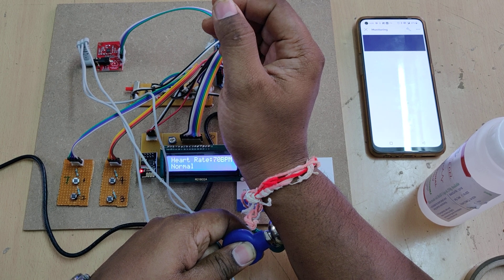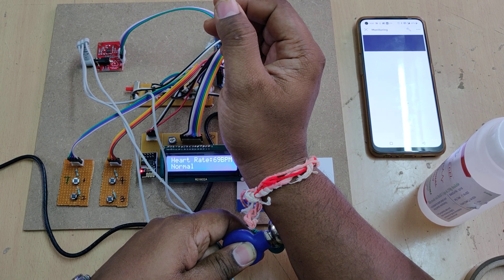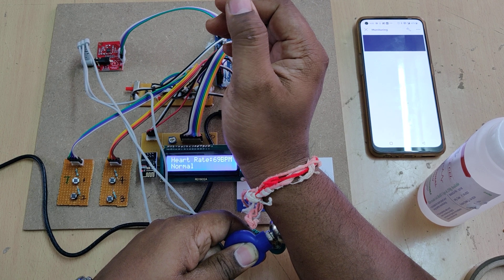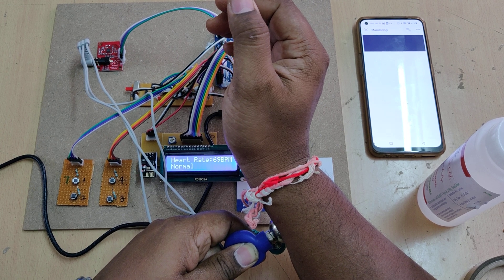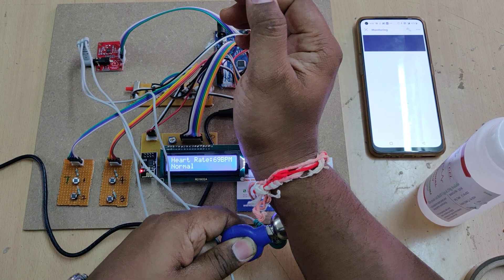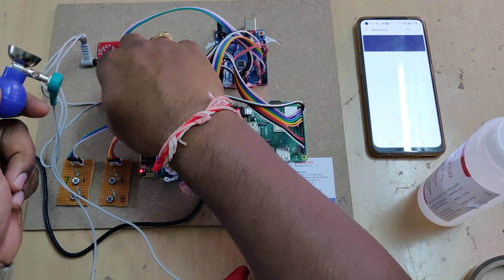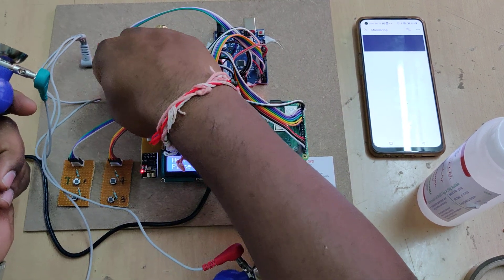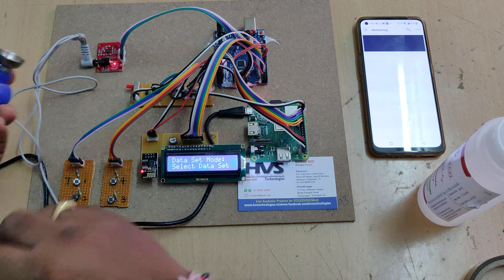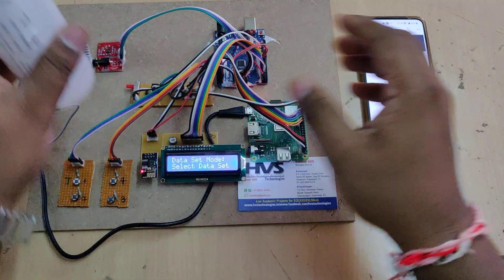Mount the electrode properly and you will get a normal reading. When the heart rate is above 100 beats per minute, it will show abnormal. If I remove that and place the electrode again in auto mode, we can check the Blynk application section.